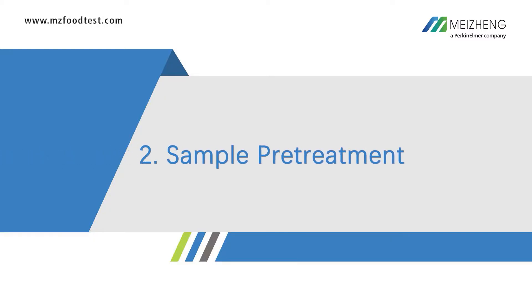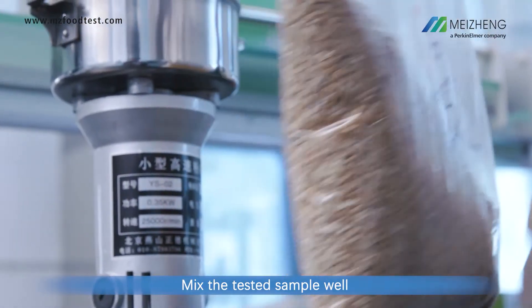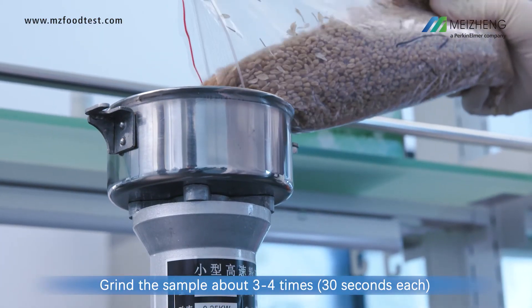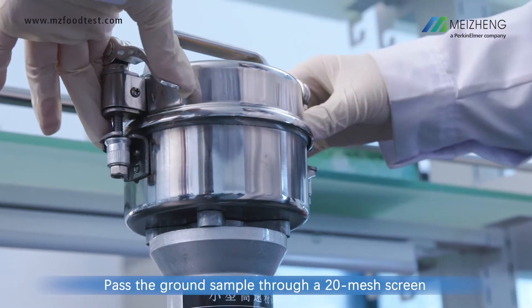2. Sample pretreatment. Mix the tested sample well. Grind the sample about 3 to 4 times. Pass the ground sample through a 20-mesh screen.